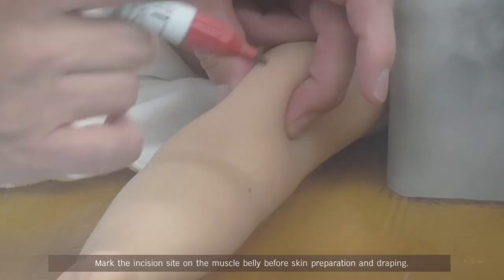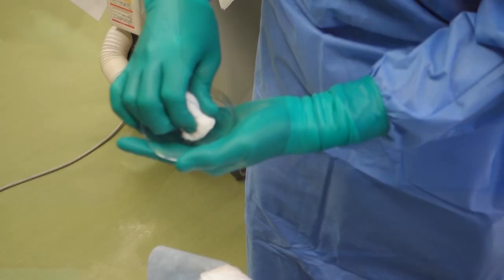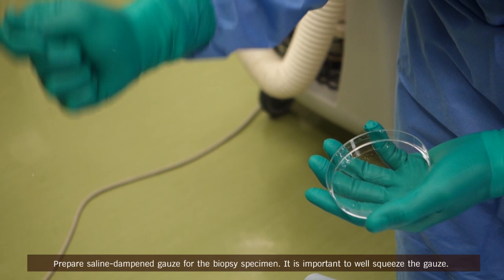Mark the incision line on the muscle belly before skin preparation and draping. Prepare saline dampened gauze for the biopsy specimen. It is important to squeeze the gauze well.